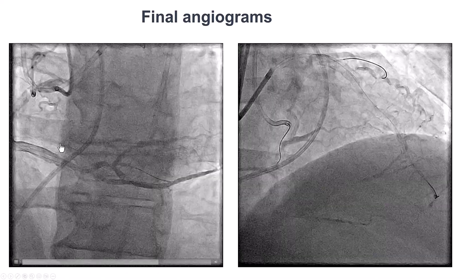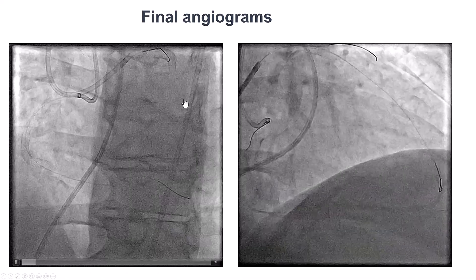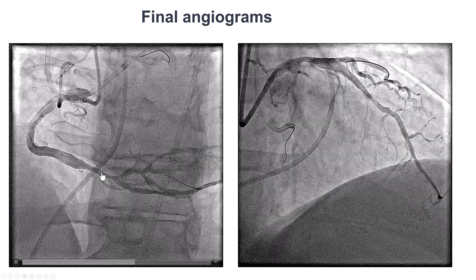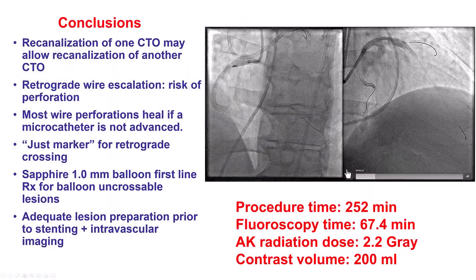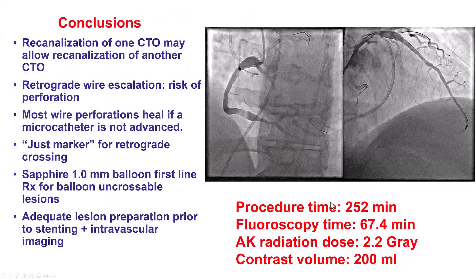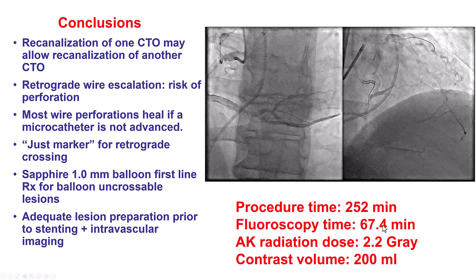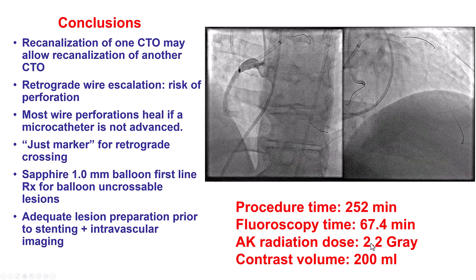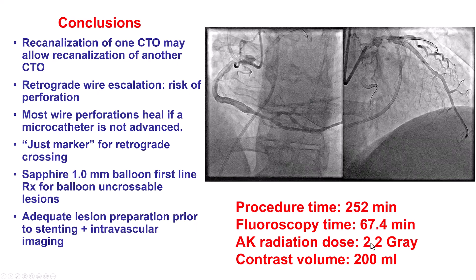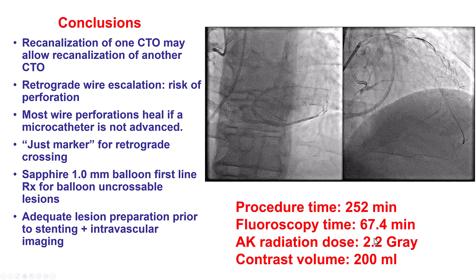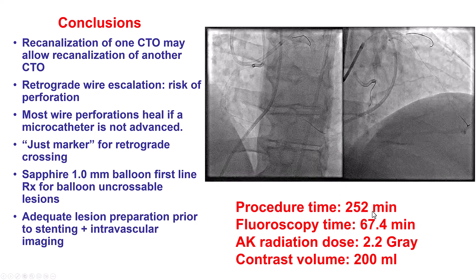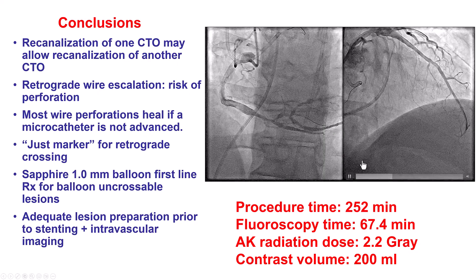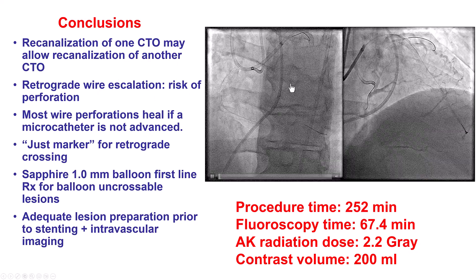Here are the final images — a good result in both the LAD and the right coronary artery. The patient did well. It was 67 minutes of fluorotime and 2.2 gray, which is remarkable given that the patient was so heavy with a BMI of 49. This is a testament to the new X-ray systems that can help reduce radiation dose.